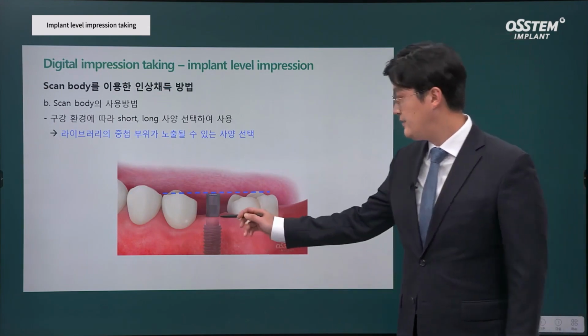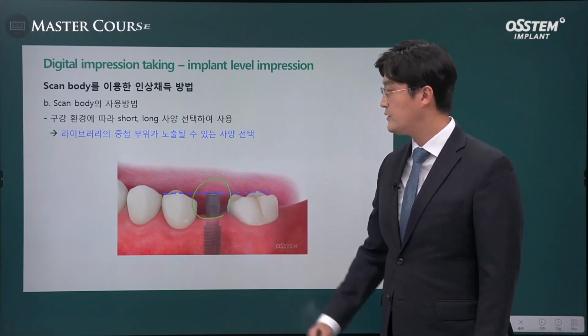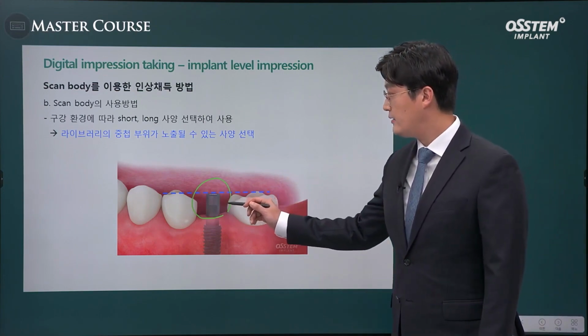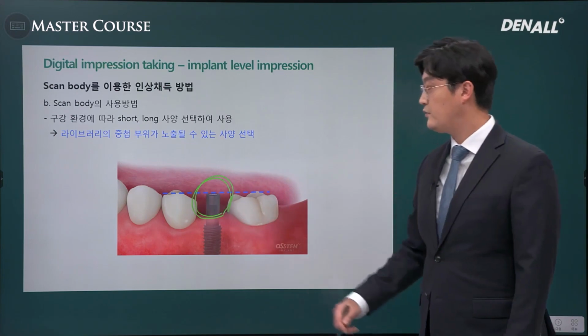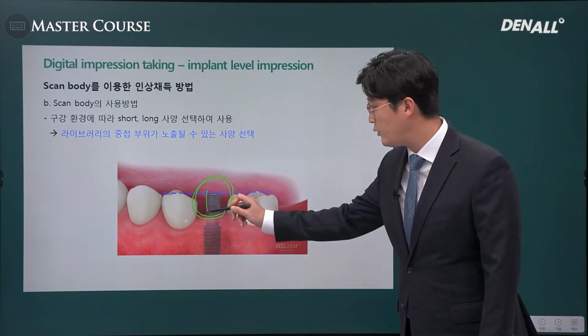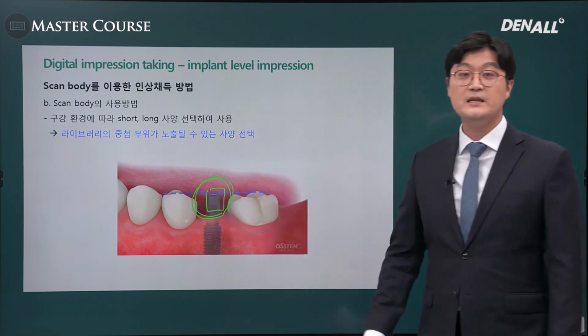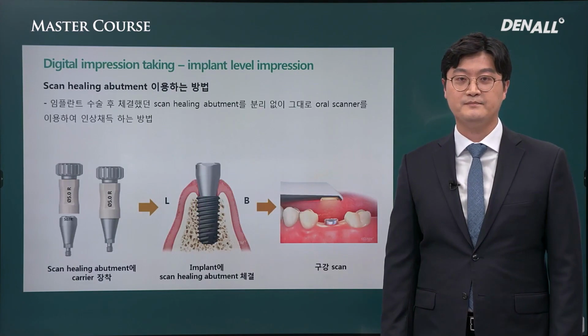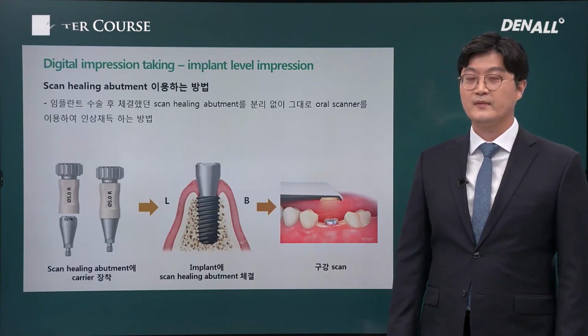A scan body is selected and inserted for scanning. Later in a CAD program, the scan body and the library in the CAD program need to be merged based on this. So this portion needs to be merged and that portion only should be exposed above the gum.